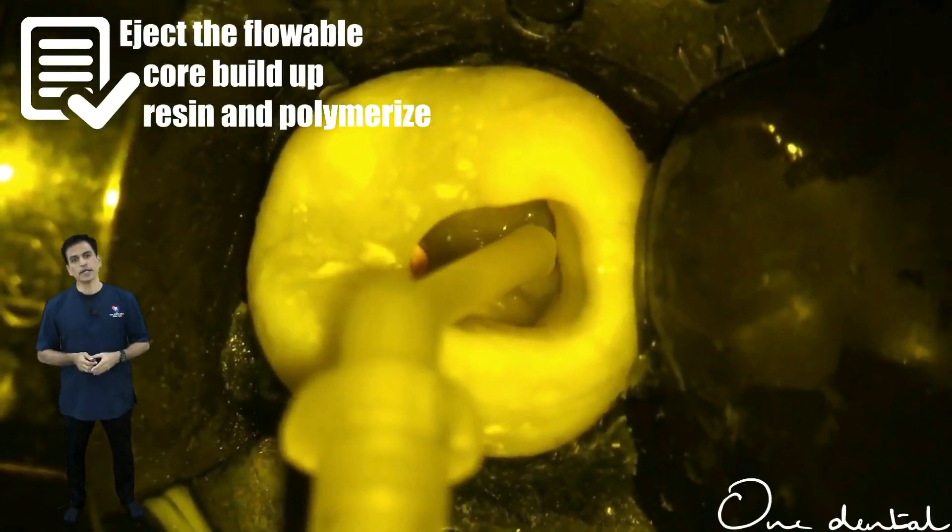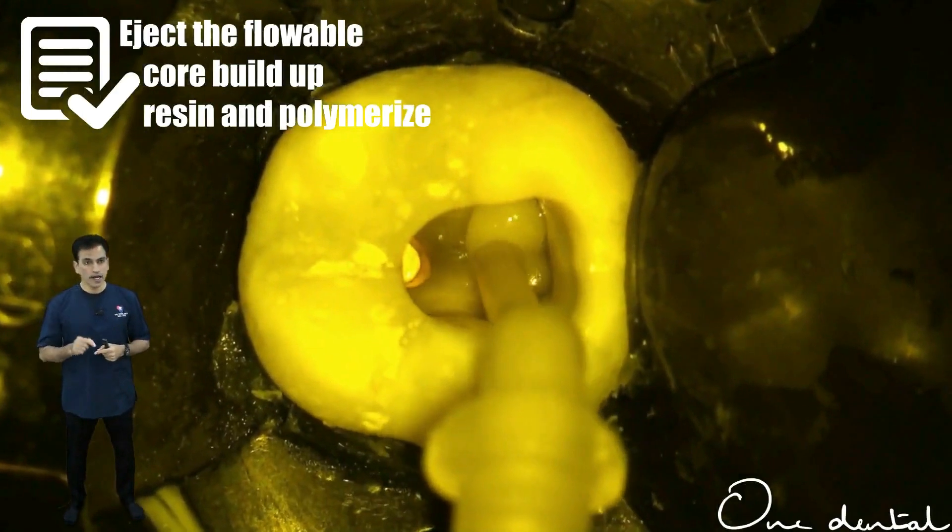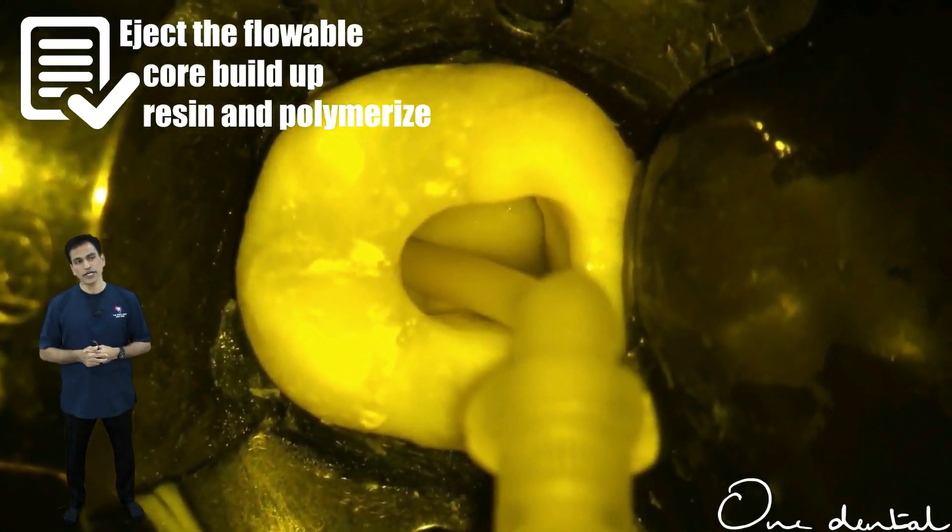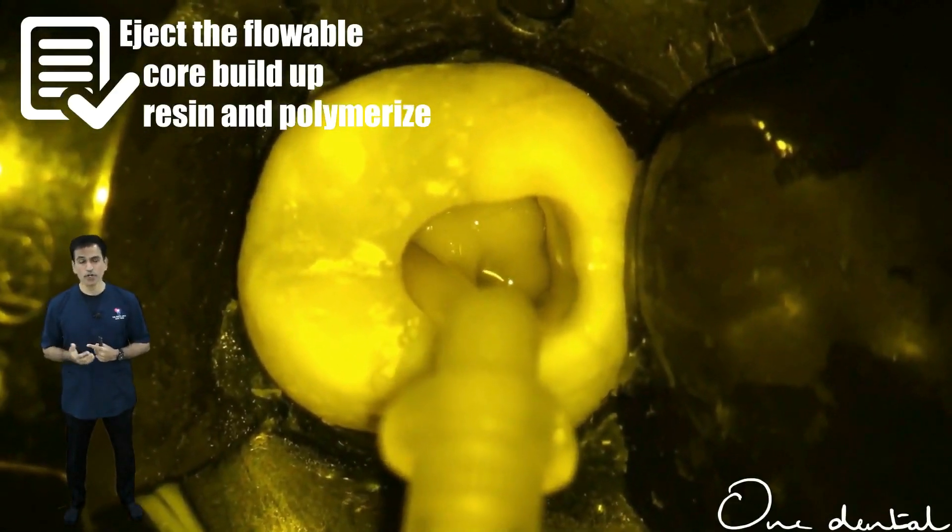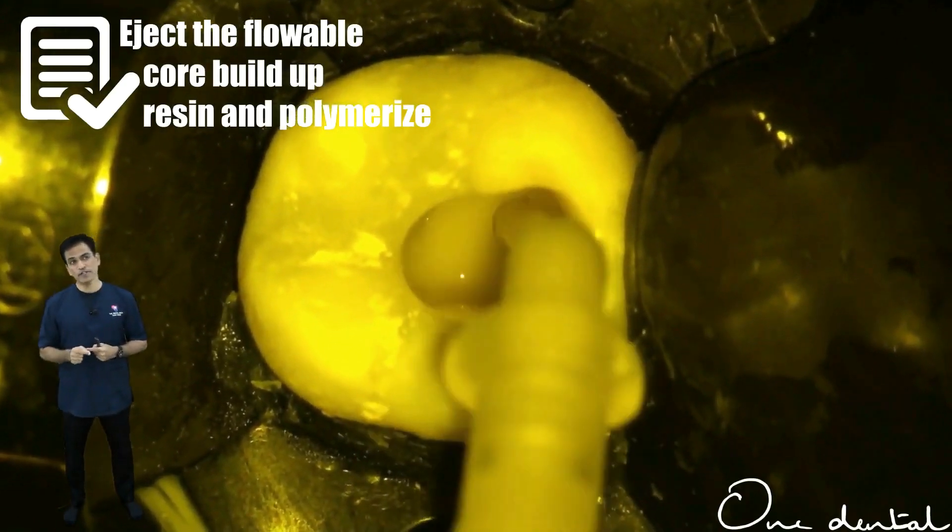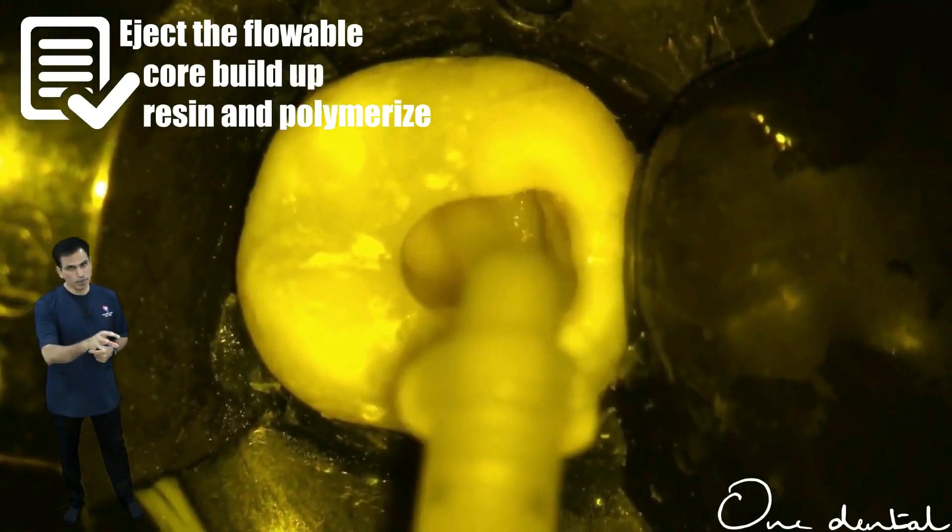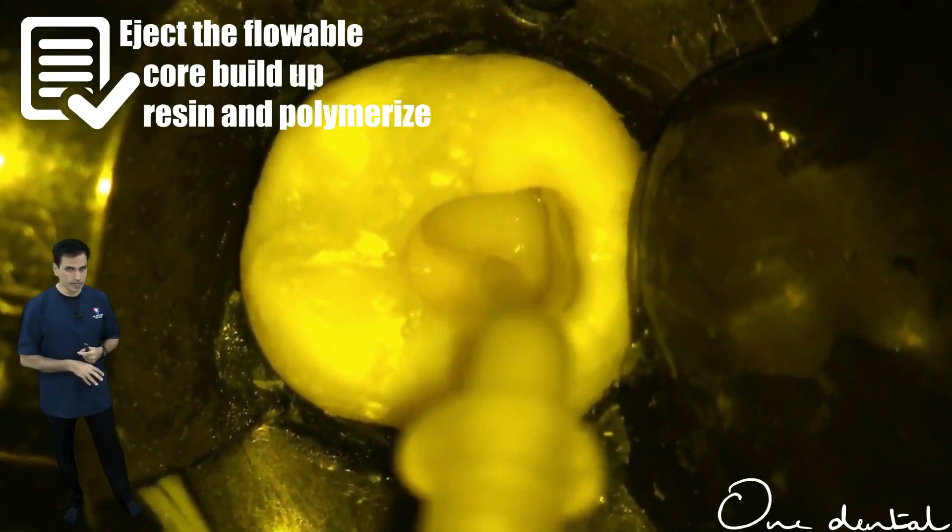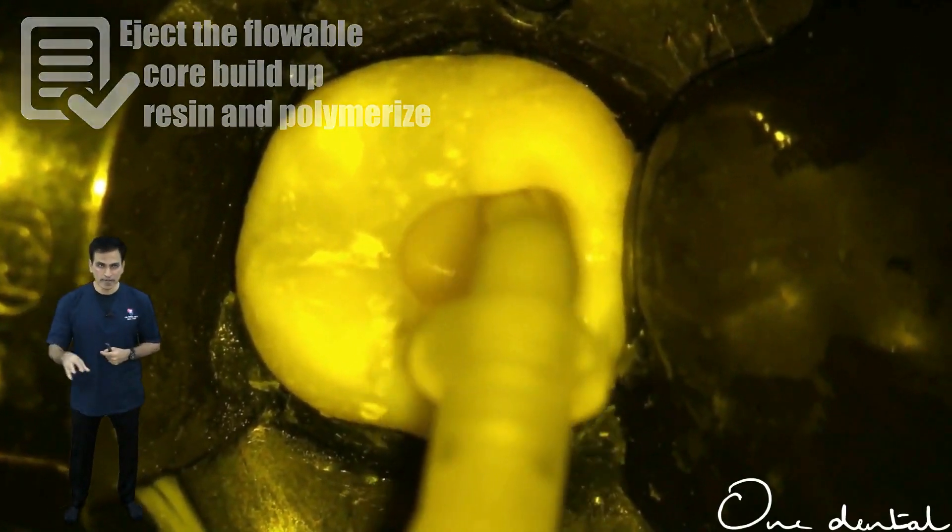We will keep the tip of the gun or the syringe in the deepest portion. Do not lift it out, you will get air bubbles otherwise. Even without lifting, start moving it from meso-buccal to mesolingual to distal. Thereby you evenly cover the deepest layer.